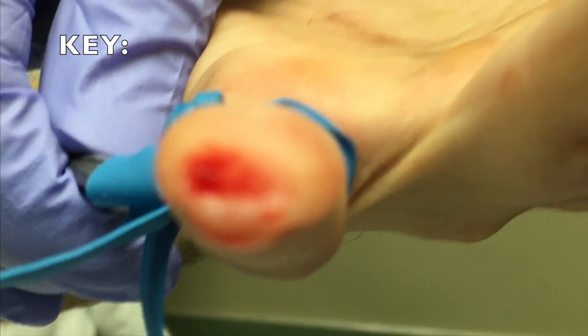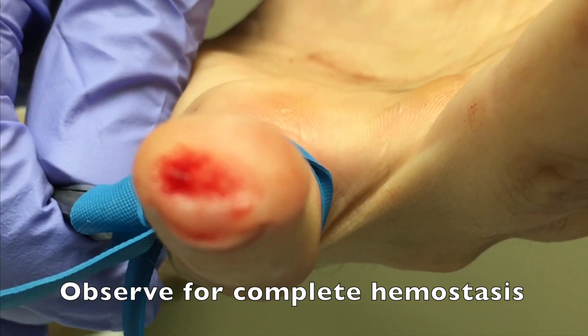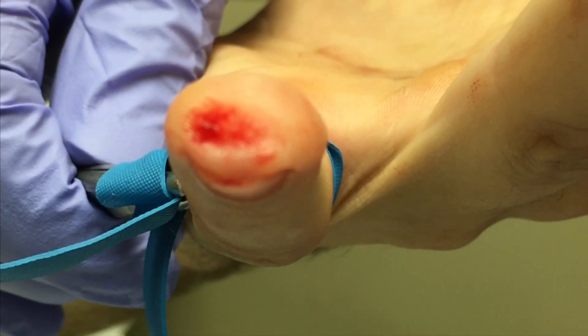A key step before you apply the glue: you want to observe for complete hemostasis of the wound — no bleeding at all from that fingertip wound.